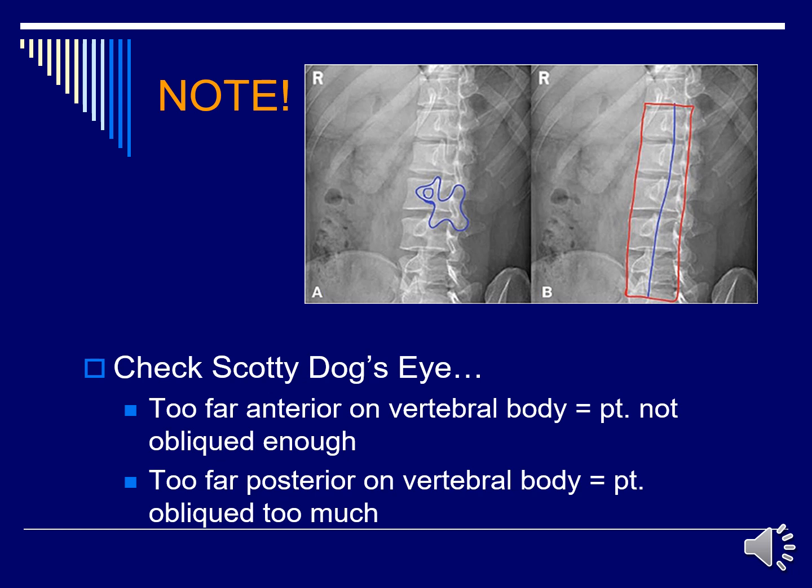Make sure that when you're looking at your oblique lumbar spine, you're looking at around the level of L3, because that one is going to look the most open with a 45-degree rotation on the patient. Now note that Bontrager says that if you are looking specifically for lumbar number 1 or 2, you want a 50-degree rotation on the patient's body.